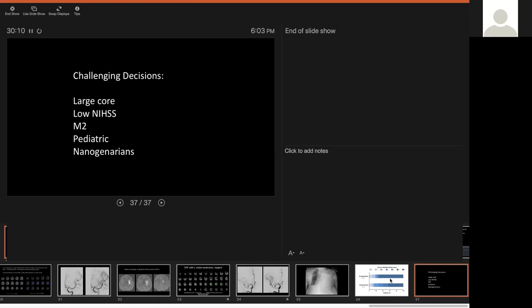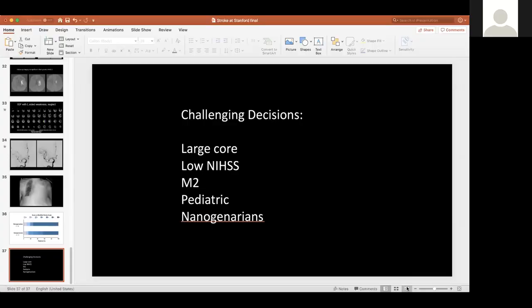So that would mean overall, maybe about 10% of MCA and ICA occlusions being imaged at 37 hours could have salvageable tissue. And of course, nobody is imaging patients who come in 2 days after a stroke, but we've been doing that over the last couple of years, and we've seen a few patients, right? Again, it's not going to be a lot because it's only about 10%. We've seen patients who've had mismatch in that late window, and we treated patients and had really nice outcomes.